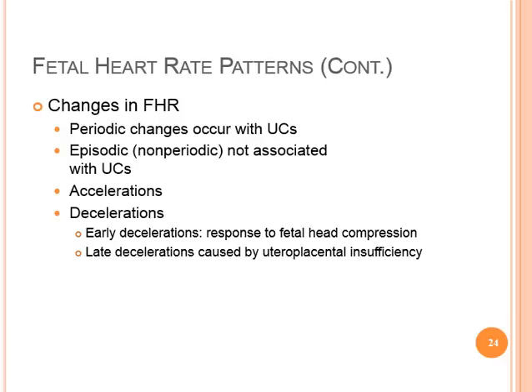Early deceleration of the fetal heart rate is a visually apparent gradual decrease in and return to baseline fetal heart rate associated with uterine contractions, with a gradual onset to lowest point of greater than 30 seconds. We know that the early deceleration is usually caused by head compression, and we consider it a benign type of deceleration.